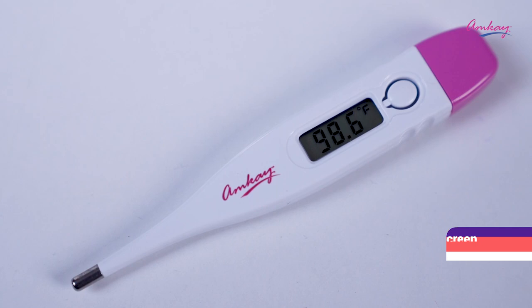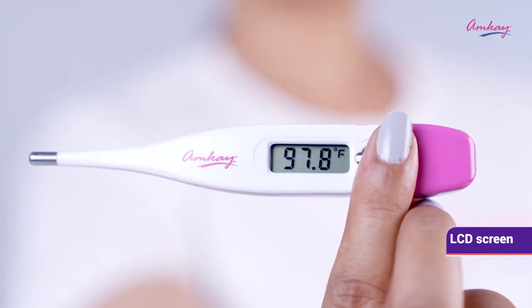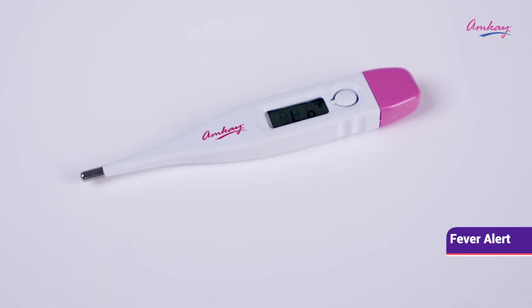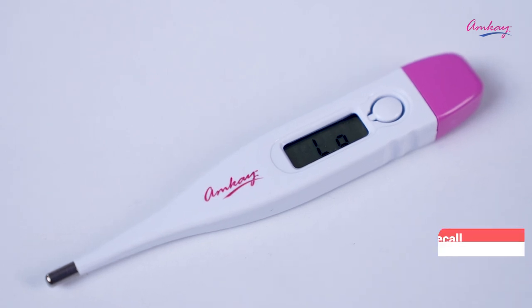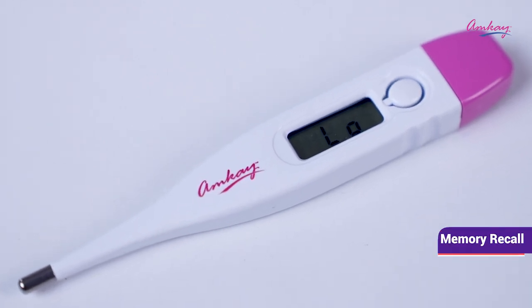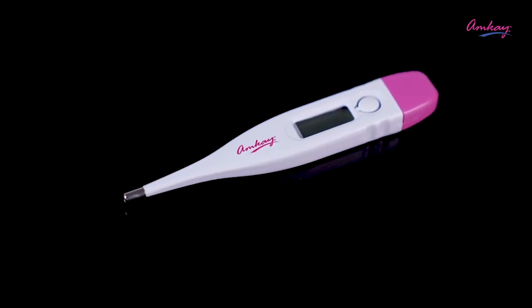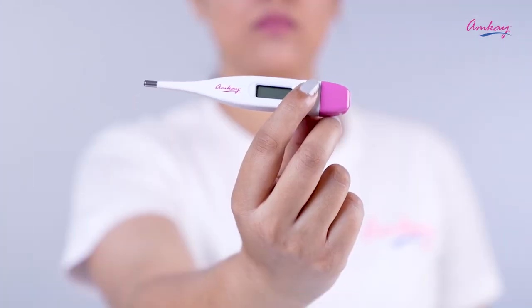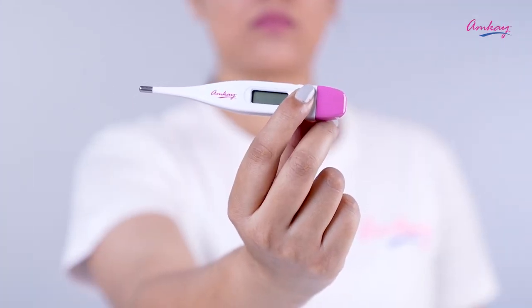It has an LCD screen which makes the readings easy to read. It has features like fever alert that indicates peak temperature, and it shuts off automatically. It also has memory recall to the last reading, and it's accurate within 0.2 degrees Fahrenheit.